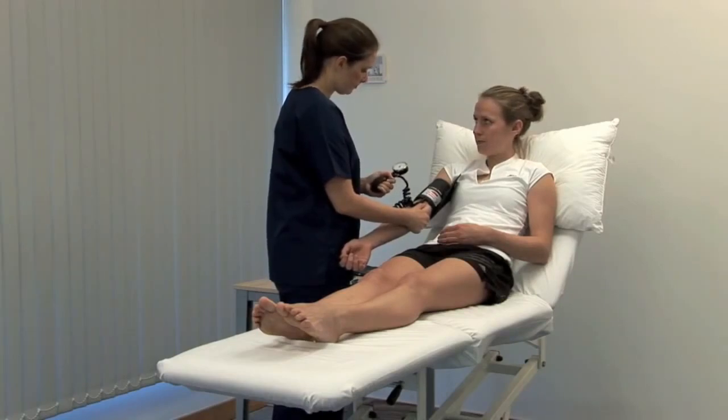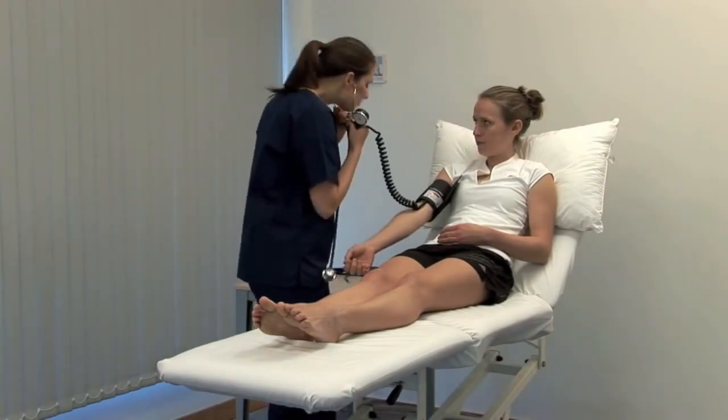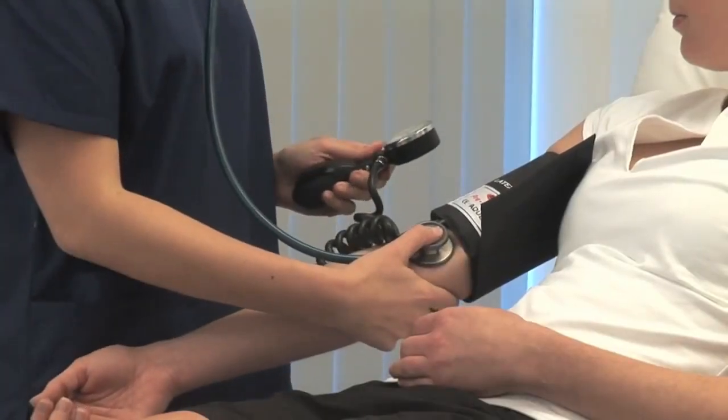Inflate the cuff by a further 30 mmHg and then listen with the stethoscope diaphragm over the brachial artery. There should be silence initially.